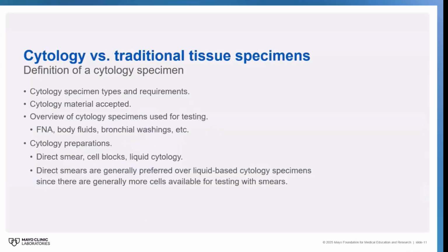So I will hand it over to Katie to talk about the cytology preparations. Hello, thanks, Dr. Lowe. I'll be covering the actual cytology portion. To start off, what types of specimens do we consider adequate for cytology testing for NGS? Normally, we consider FNA smears, touch preps, and cytology from liquid-based preparations like ThinPrep and SurePath. Generally, these are stained with stains like the Papanicolaou stain, the Diff-Quik stain, and occasionally we'll even see H&E stained cytology specimens. All of that is accepted.